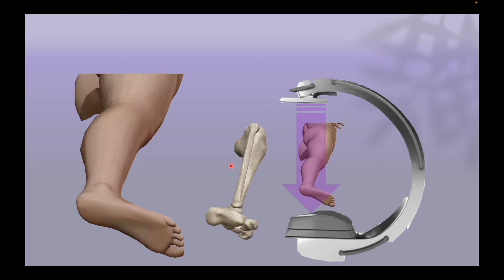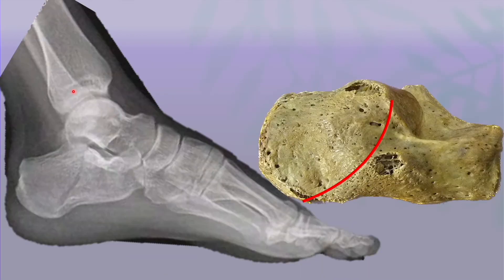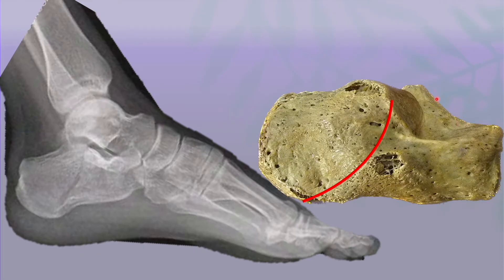Conventionally we operate on the calcaneum in the lateral position. The lateral view is performed by going orthogonal to the horizontal plane when the foot is lying in the horizontal plane. The fluoroscopic beam passes orthogonal to the ankle to give a lateral view. In this view we see the tuberosity and the posterior facet. The line just over the posterior facet represents the sustentaculum tali. Then comes the anterior process.